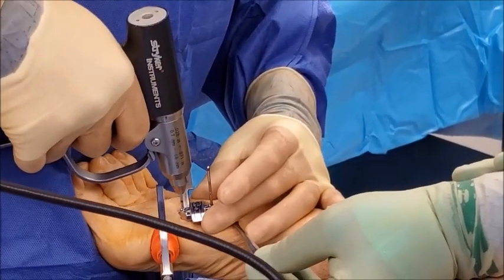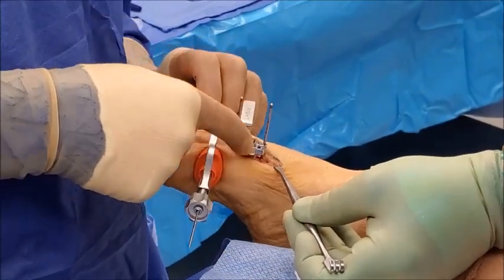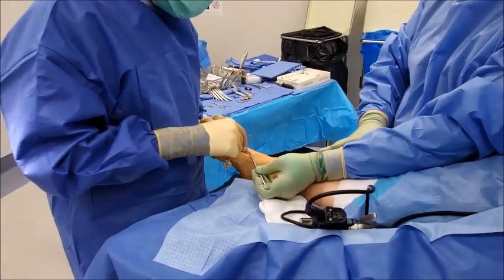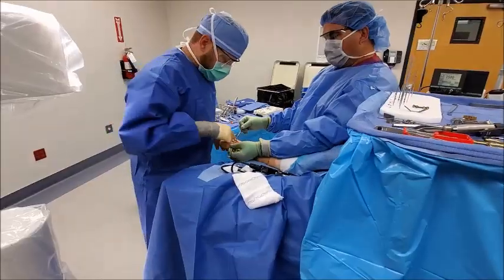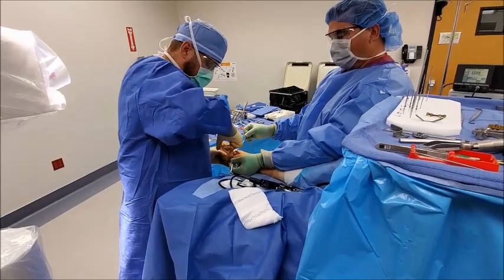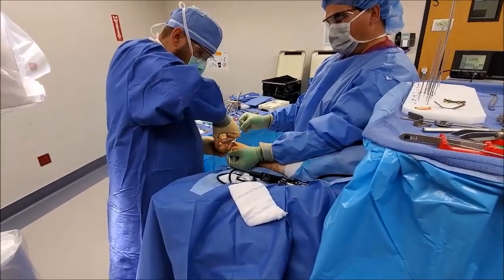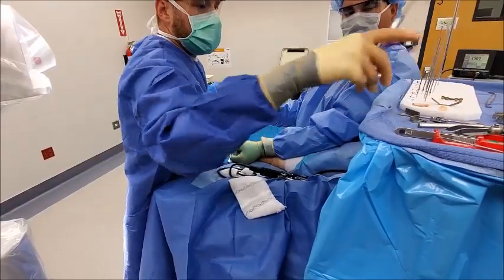Another great part of this procedure is the cutting guide, which we lock in place. This takes the guesswork out of fusing this joint — there's been a surgery called lapidus that's been around for a long time, but it was done entirely freehand. This system standardizes the cut so it's the same every time. We've completed our cuts and the next step is to remove the cartilage from the joint, taking it out in one piece as much as possible, leaving two raw surfaces of bone.